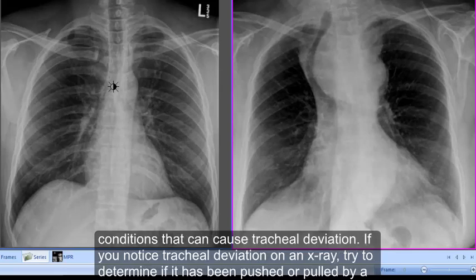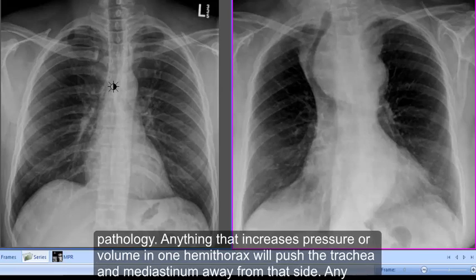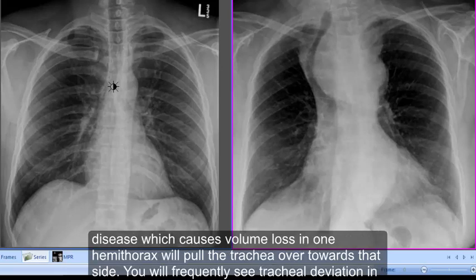If you notice tracheal deviation on an x-ray, try to determine if it has been pushed or pulled by a pathology. Anything that increases pressure or volume in one hemithorax will push the trachea and mediastinum away from that side. Any disease which causes volume loss in one hemithorax will pull the trachea over towards that side.